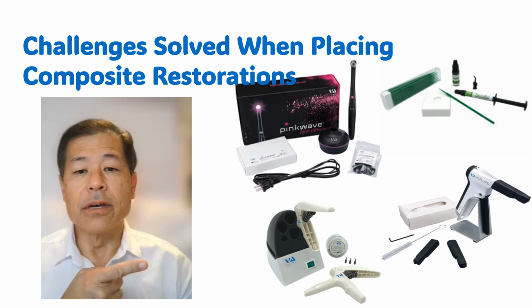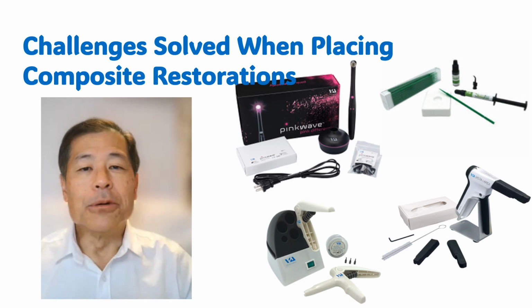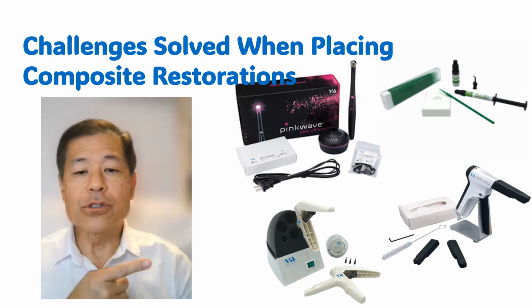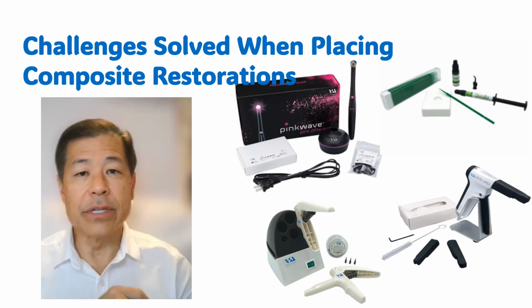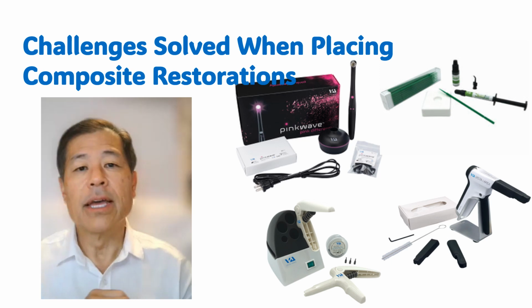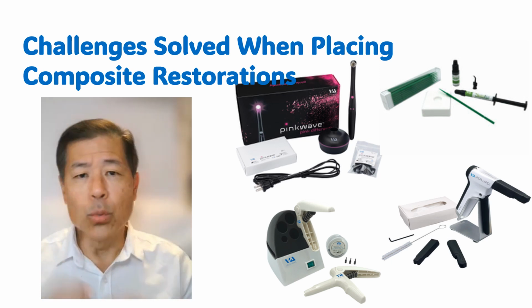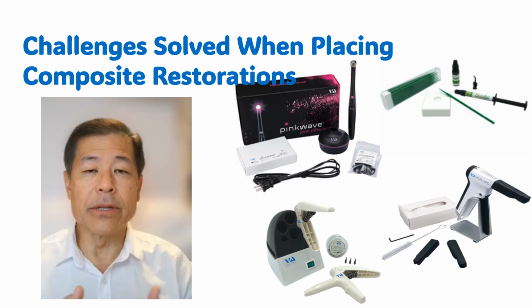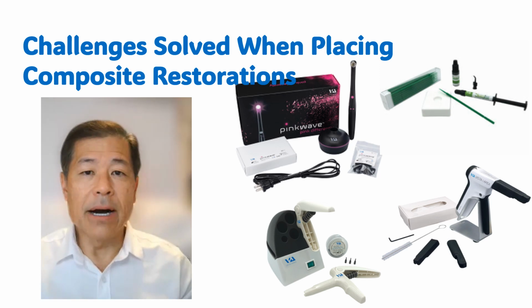Over here on the other side of my slide, at the very bottom, those are composite warmers. Now the first one closest to me, that's a benchtop composite warmer. We've been using that for years, works really, really well. And if you haven't heard about warming your composite, one of the big companies making a big push has been 3M recently. Why? Because it makes placing a composite so much easier.